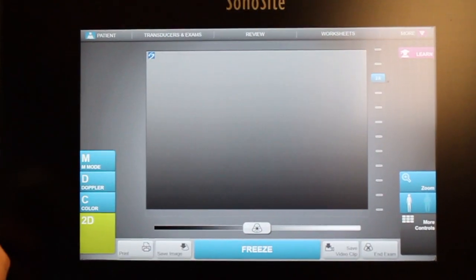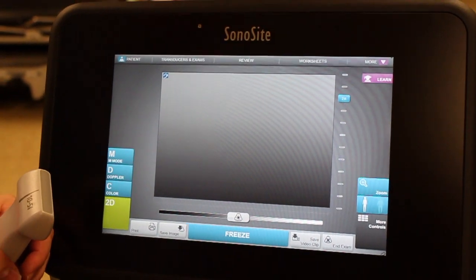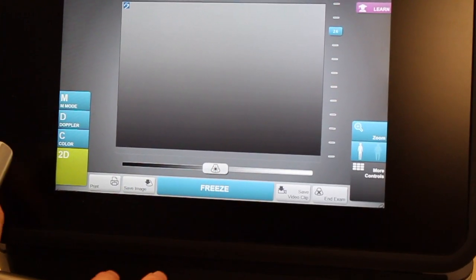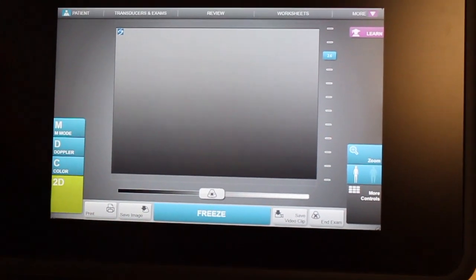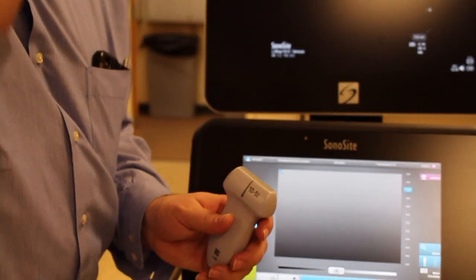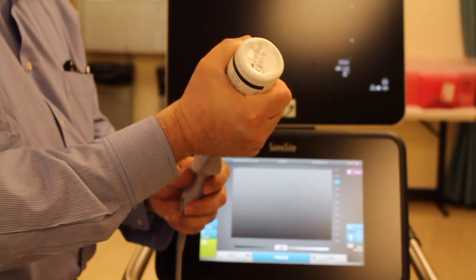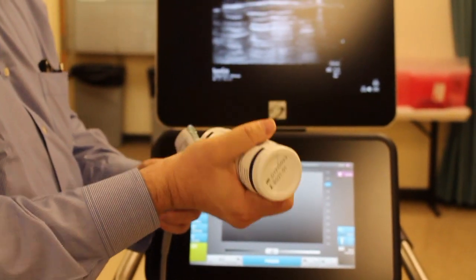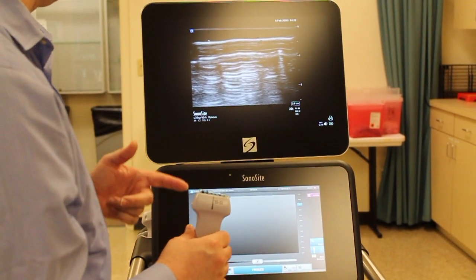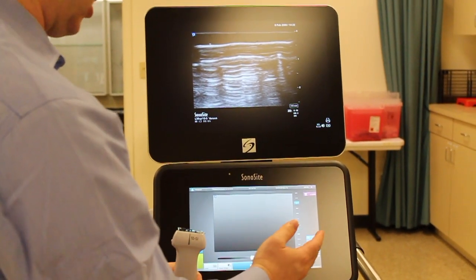That's how to change the depth — one setting you're going to want to be able to manipulate. Next we're going to look at what's called the gain, which I think of simply as just the brightness or clarity of the image. In order to show how effective this is, I'm going to put some acoustic gel — a coupling agent — on the probe. The sound waves do not travel well through air, but when we put gel on it we can see the image better, and I'll show you what the effects of adjusting the gain are.